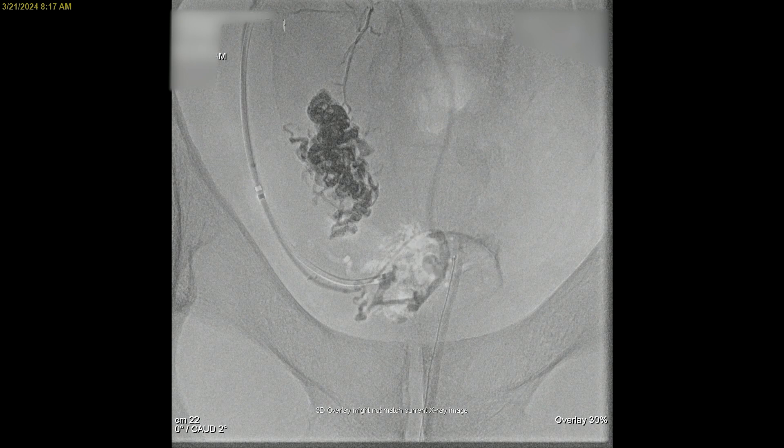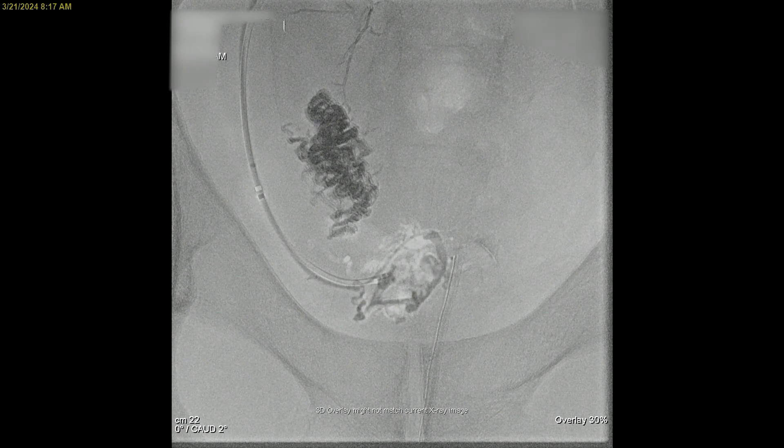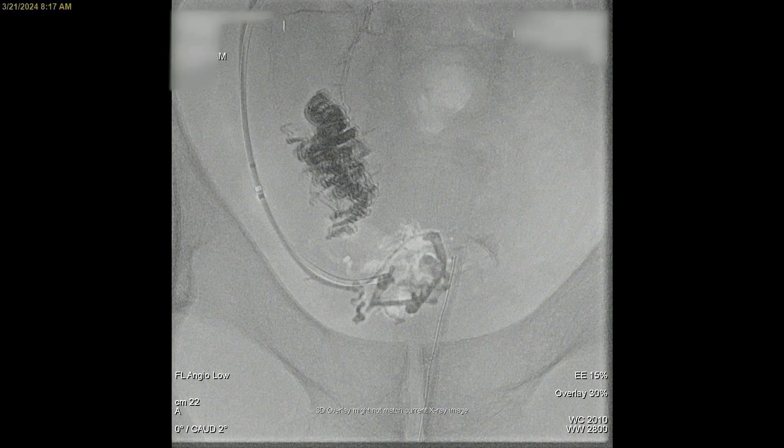As it fills, if the onyx is going forward, you leave the microcatheter in place. If it's backing up, then you pull the microcatheter. As you pull it, it can drag the onyx back — deep in the pelvis like this that's not a big deal. But if you're working in the profunda, close to the takeoff of the superficial femoral artery, you worry about pulling a piece of onyx back into the axial circulation and having it go downstream.